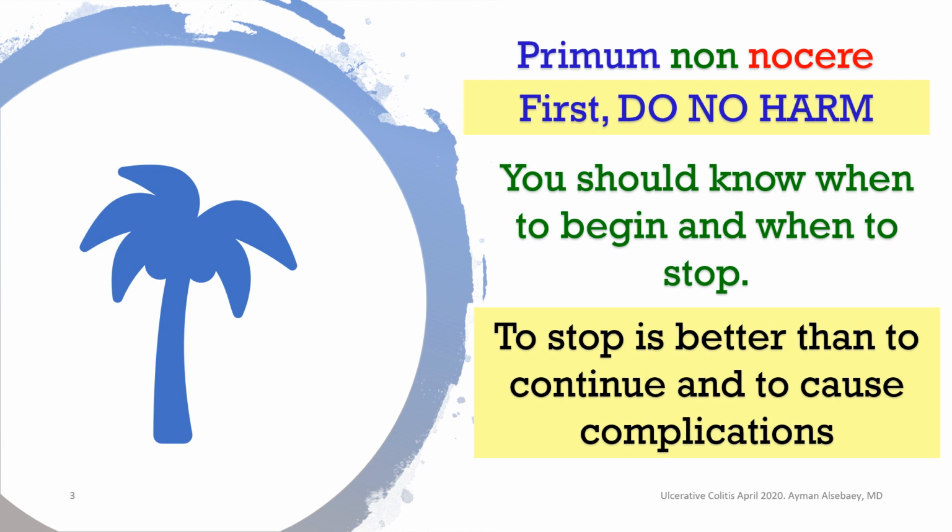The second point you should learn is that you should know when to begin and when to stop. That is to say, you should know the indications of the endoscopy, and you should know when to stop the maneuver when you think that the risks are more than the benefits. The third wisdom is that to stop is better than to continue and cause complications. And always remember Napoleon, who said, "I don't want to have two diseases, one natural and the second one caused by a doctor." If you put these wisdoms in your mind, you will be a clever endoscopist.